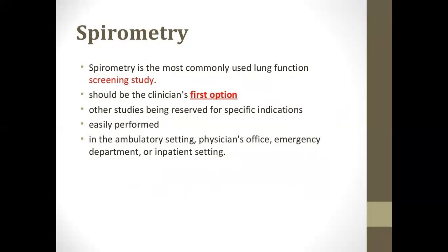It should be the clinician's first option, other studies being reserved for specific indications. It is easily performed in the ambulatory setting, physician's office, emergency department, or inpatient setting.